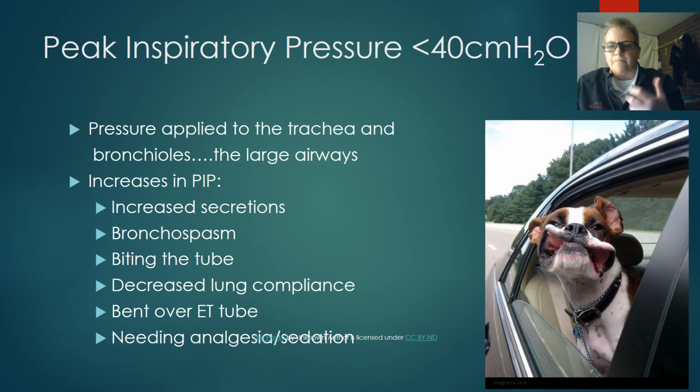bronchodilators. What if the patient is not properly pain controlled with sedation, and they're biting that tube? They're fighting. That's going to cause high PIPs. Decreased lung compliance, maybe due to the disease processes that they have, or increased pulmonary edema, or anything like that.